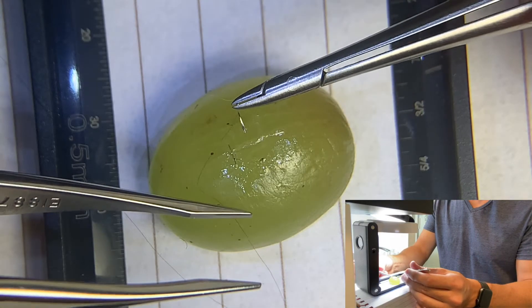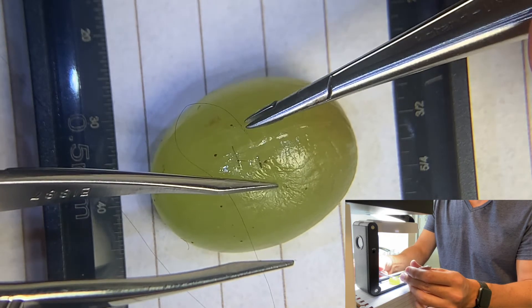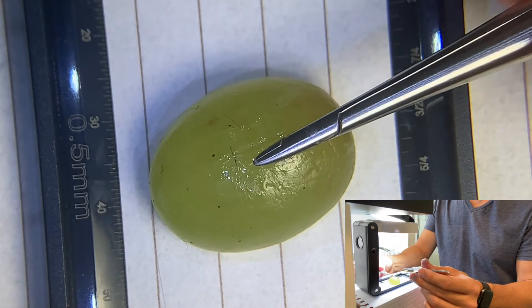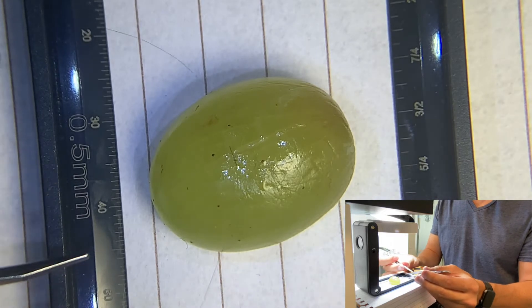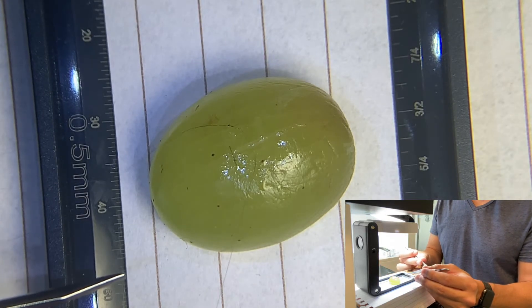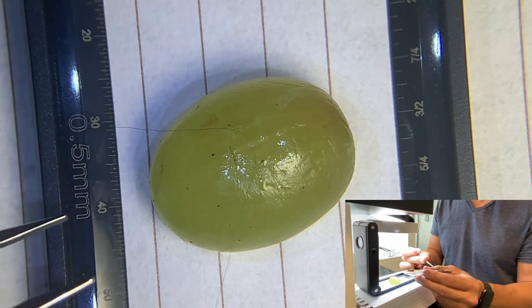The first thing: if I don't have to grab the tissue, I don't. Push, push, pull. And when you pull, you want to pull with the curvature of the needle. We're pulling to our left inner elbow, because I'm right-handed in this case. We're pulling until we see the suture end — we're looking for the suture end over here.